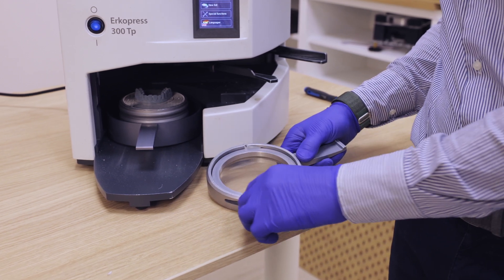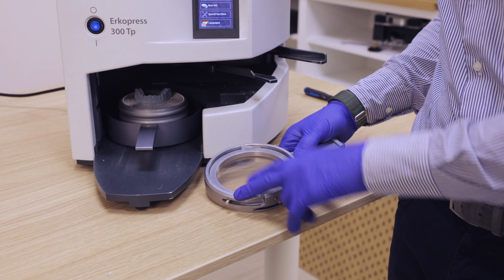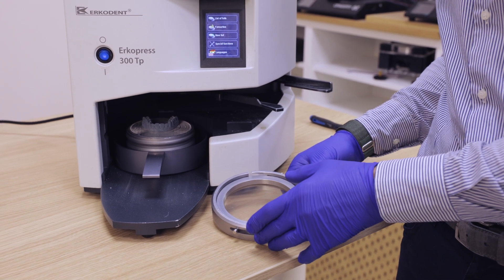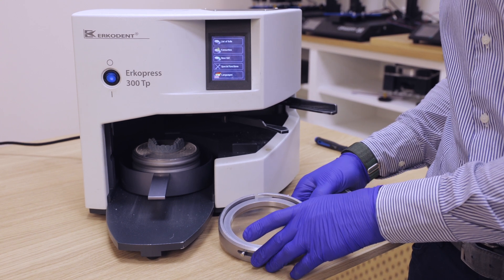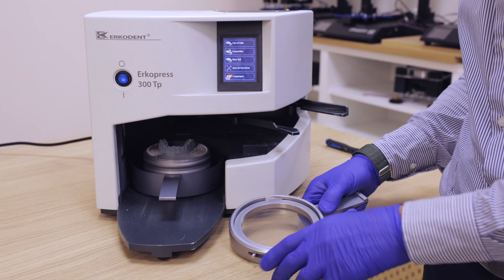In this case we are using the Erkopress from Erkodent, but you can also use a Ministar or another press that you like — it doesn't matter. What is important is the plate for thermoforming.